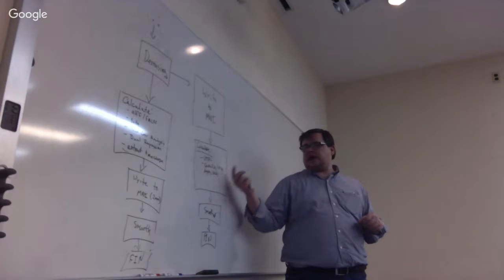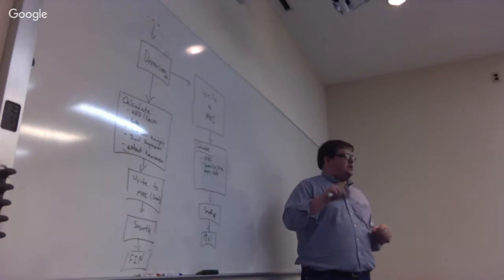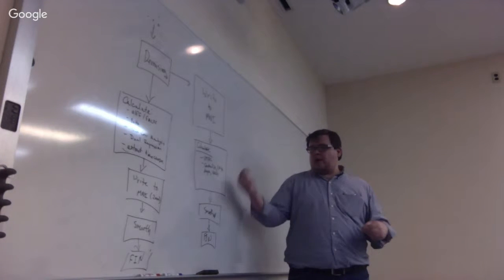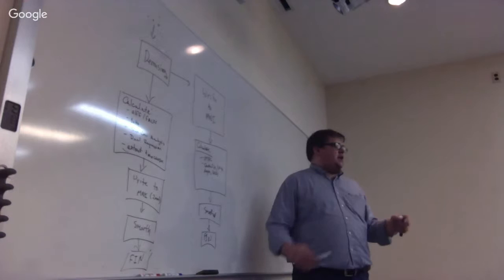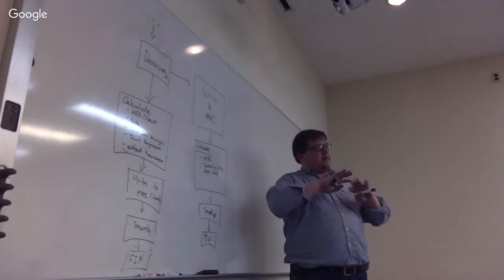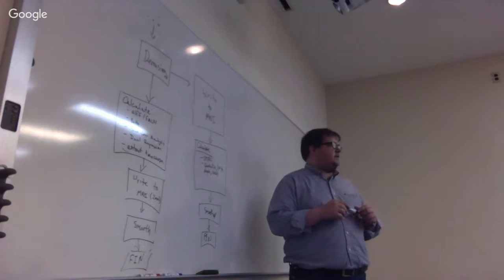Also, different centrality measures are sensitive to the number of voxels that you include in the brain, right? To keep that consistent across all the individuals as a way to normalize that, we do the analysis in MNI space, and we use a standard template across all of the individuals for the gray matter, so that we're restricting it to gray matter, and there's always the same number of voxels in everybody's brain, okay?